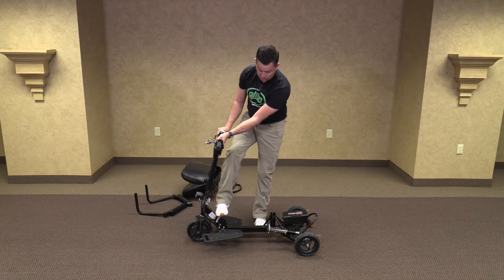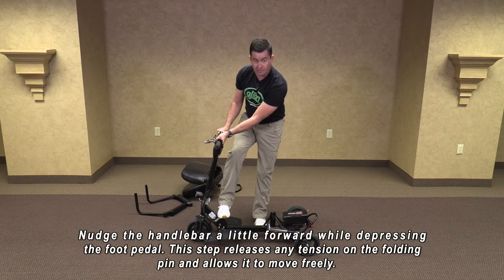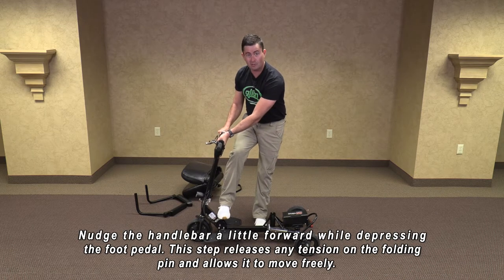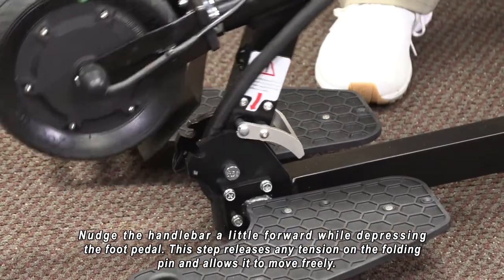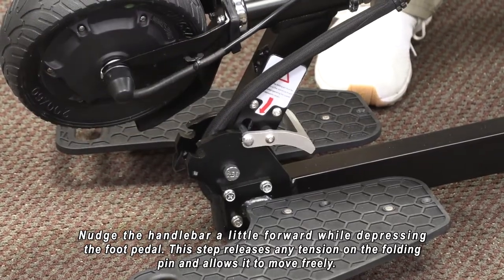Now let me show you how to lower it. You push down on the foot pedal, making sure to hold the handlebars so you don't lose them and they fall down and hit yourself accidentally. Lower it down. It clicks into place and it's ready to go.